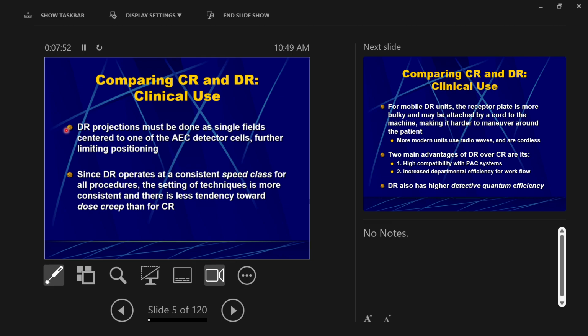Nowadays, we have image stitching, we have side-by-side viewing software, so we don't have to worry about that so much. Do you know why we do it? It's not for ease of use. It's a reason from film radiography. Has anyone ever told you why we do multiple on one plate? It was to save film.